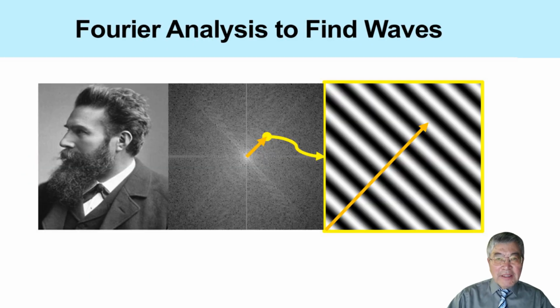For image reconstruction, we can also take the other perspective, namely the wave point of view. From this viewpoint, an image is treated as a superposition of many waves in 2 dimensions. These are two-dimensional sinusoidal waves with different spatial frequencies and directions. The Fourier transform provides a convenient way to extract these wave components from an image.